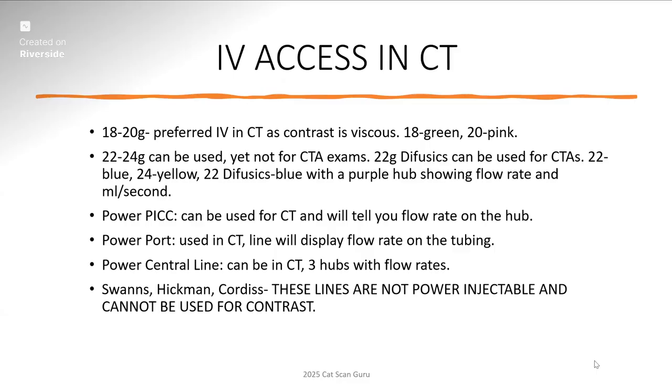Now, I'm going to stress this very importantly because I go back and forth with nurses every single day. When it comes to a Swan, a Hickman, a Cordis, or even a Broviac on a baby, okay, these are sheaths. These lines are not power injectable and cannot be used for contrast. Please do not do this because these are used in trauma protocols and cardiac patients. These are not power rated by MedRad.